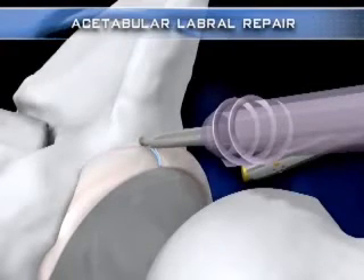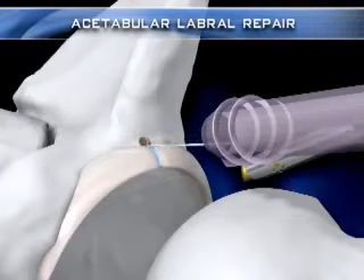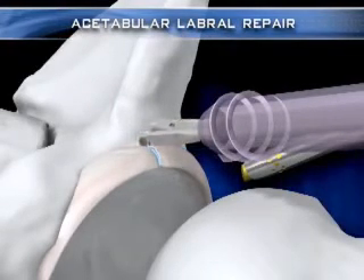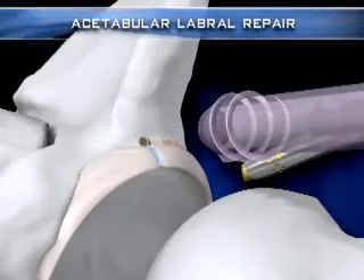The pushlock handle is removed by turning it clockwise six full revolutions while gently pulling back. The remaining suture tails are clipped using a suture cutter. Multiple pushlock anchors can be placed in the acetabulum according to the size of the defect.